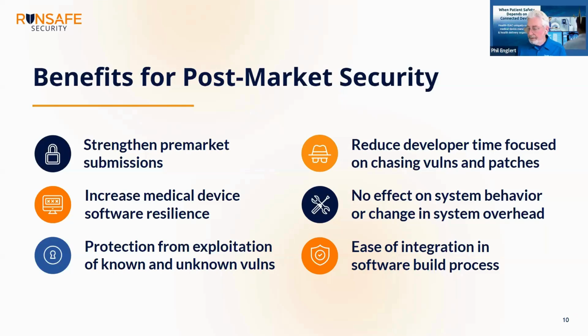Shane, I have a question related to that. One of the things the FDA has been talking about with submissions is the complete map, from the threat analysis where you identify the ways that hackers might exploit these kinds of technologies. What's the risk assessment? What are the CWEs? How are they done? And then the controls that are put in place.